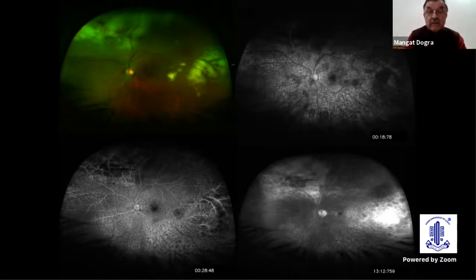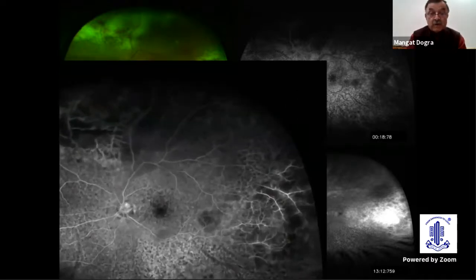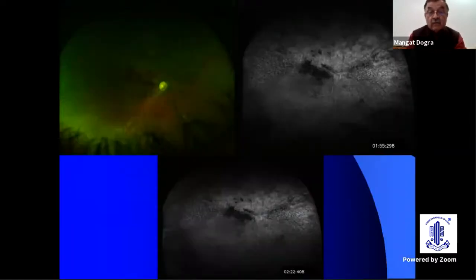You can see the different features, how they look, where you have these deposits and other areas where you have almost a leopard skin appearance, which is so important to demonstrate. And of course, look at the angiograms here. You can see these vessels, and you have leopard skin here, as well as vessels over areas which are leaky. They are over those areas where you have subretinal deposits. And this is the autofluorescence over here.